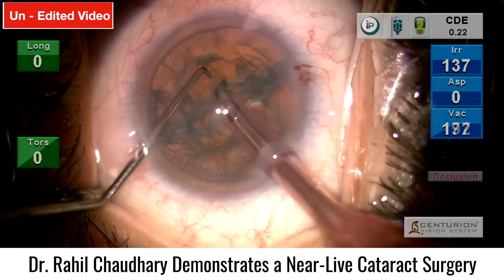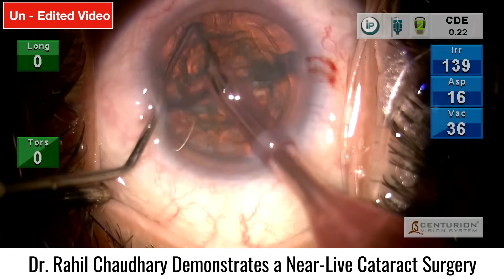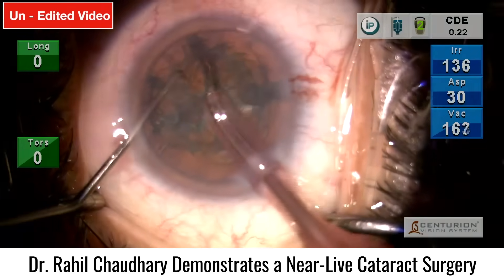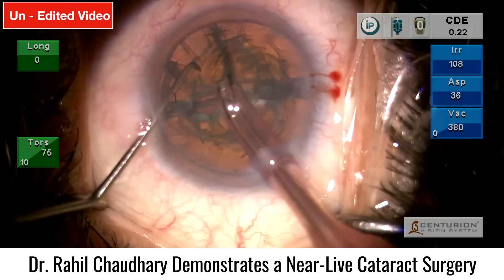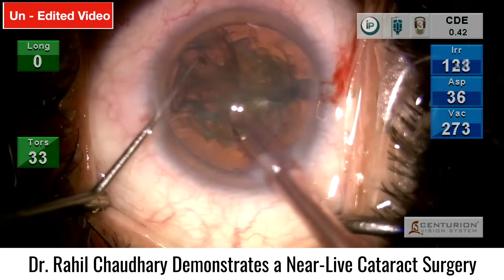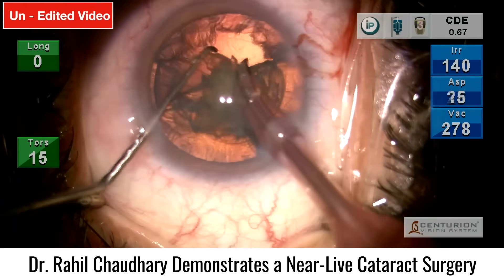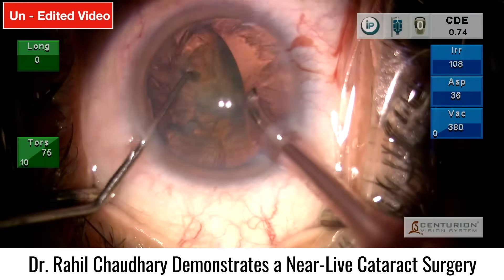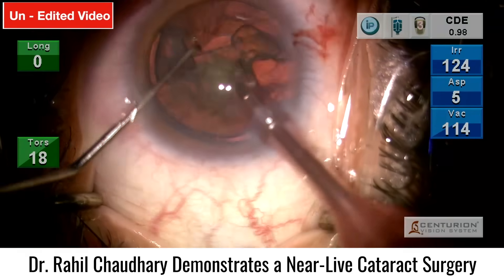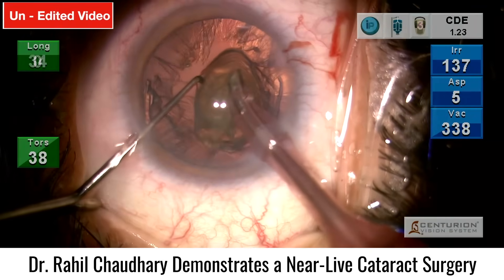This is like any other routine MICS surgery. What we want to highlight in this surgery is the new lens — the EDOF lens, the PureC from Johnson & Johnson. It is the first purely refractive EDOF lens available in the market. Before this, even with Vivity it is a hybrid concept. The biggest advantage of a purely refractive EDOF lens is reduced dysphotopsia — reduced halos, glare, and spider webs at nighttime.